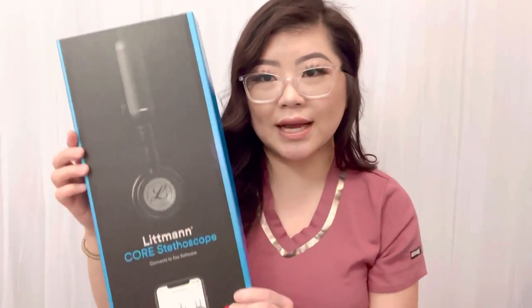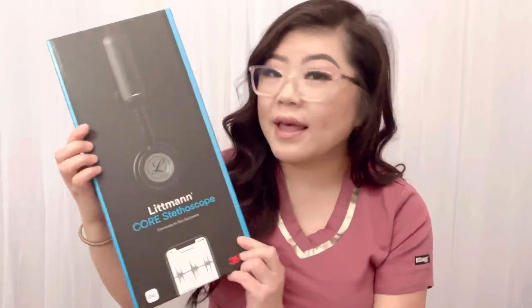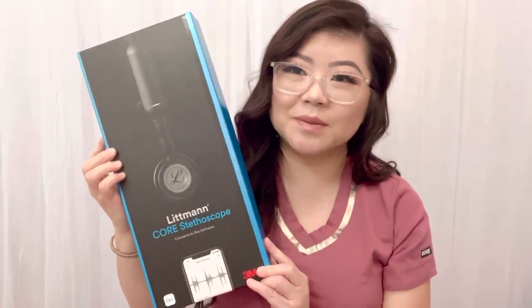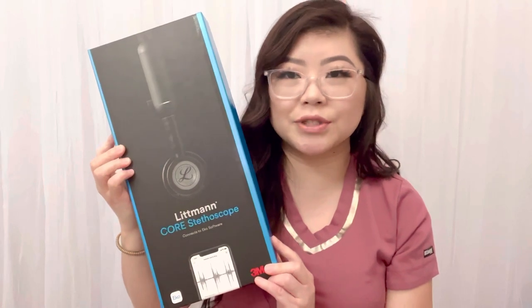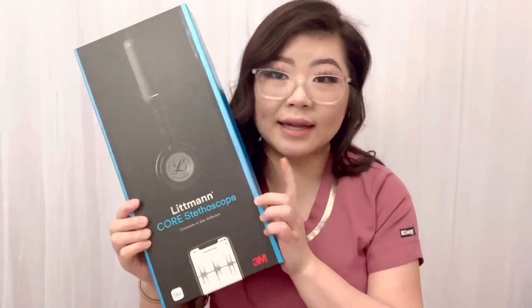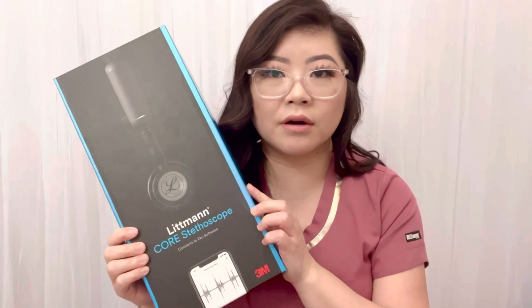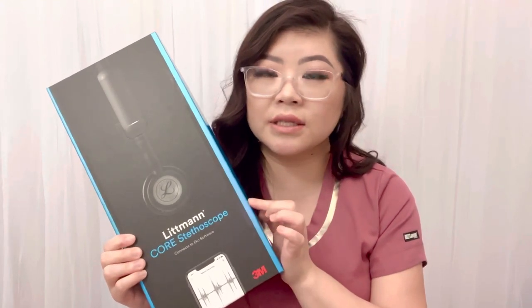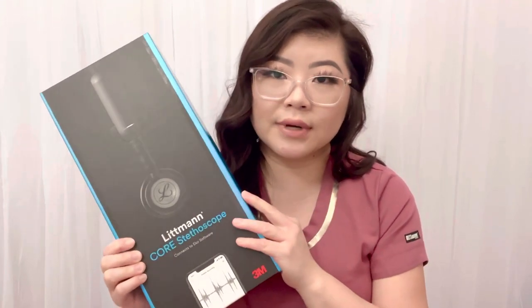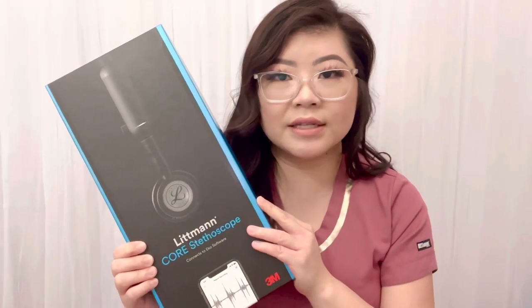The first product I'm going to show is actually the new Littmann CORE stethoscope. This is a very big investment — it's my biggest purchase I've ever done for nursing, even more expensive than my scrubs. I got it on Amazon. For Littmann there are four series, and including this one it would be the fifth series. They all range in prices and this is the most expensive one.